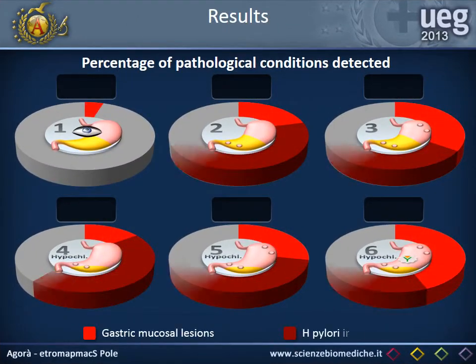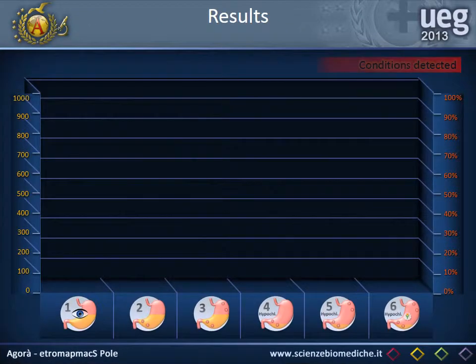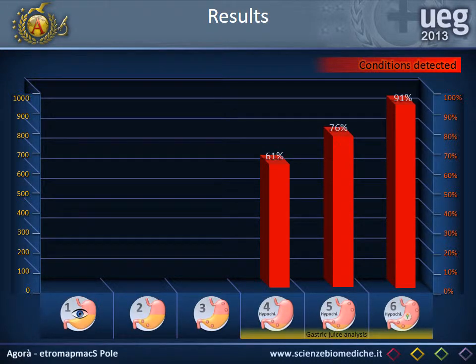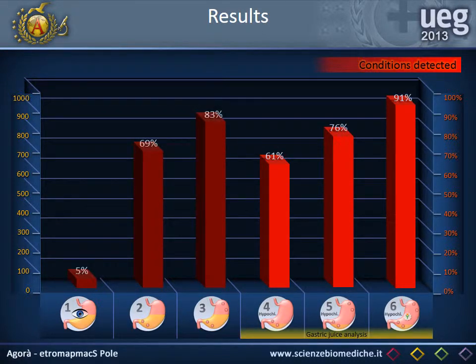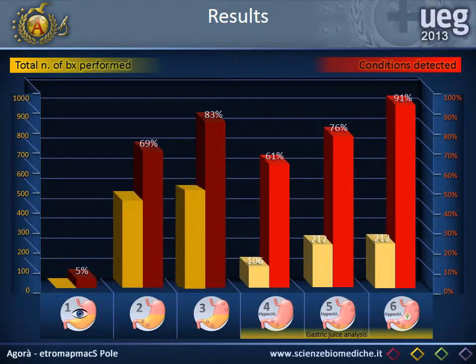Endofaster reported a good diagnostic rate for H. pylori; both sensitivity and specificity were more than 90%. Diagnostic strategies based on real-time gastric juice analysis yielded detection rates comparable or even higher than those of strategies involving biopsies for all patients but without gastric juice analysis, and this despite a four-fold lower number of biopsies performed.